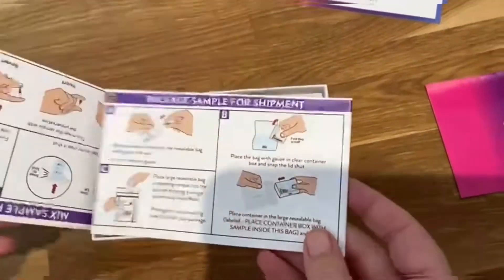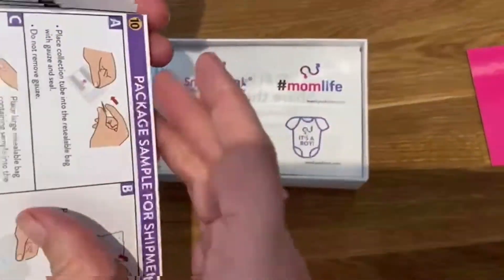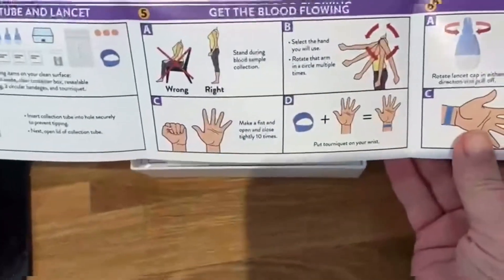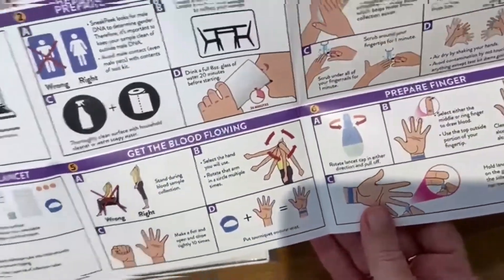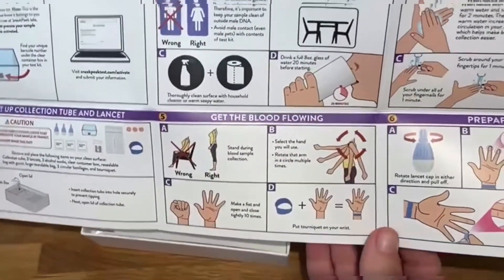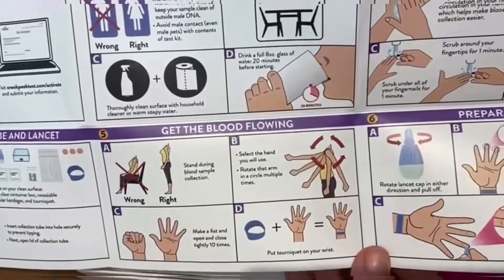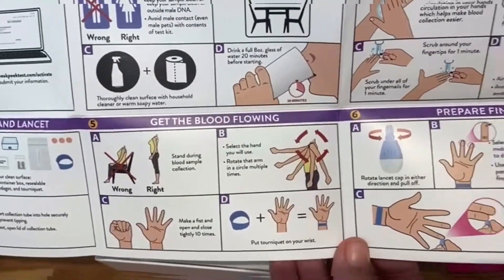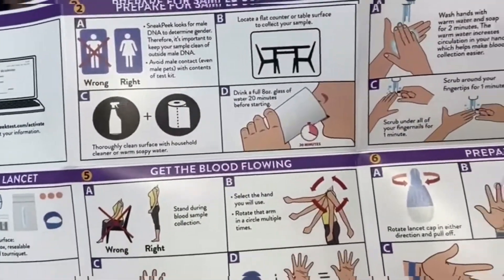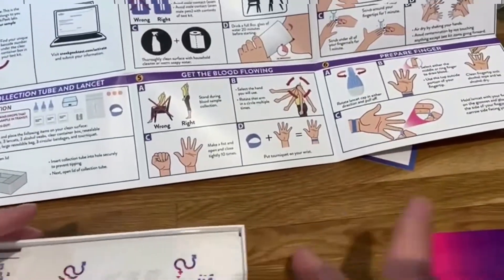Here are the instructions. Find your unique barcode to prepare for a sample. You need to drink lots of water and sanitize your hands — I've done that. Then set up the collection tube and lancet, get the blood flowing, and prepare the finger.